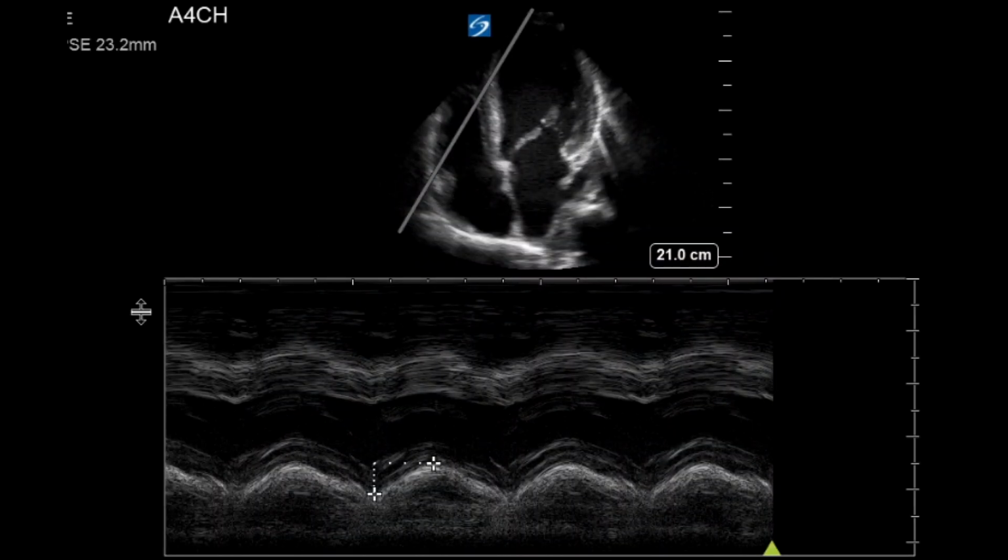So right now they're trying to show something called TAPSE. You remember what TAPSE stands for? Yes, we just talked about it. It's tricuspid annular plane systolic excursion. Good. So that is another technique where we're using M mode, but instead of looking at the tricuspid valve, we're looking at what's called the tricuspid annulus, which is a soft tissue around the valve, and it's on this lateral free wall. So they have the cursor over the lateral free wall of the RV, and you're measuring the up and down movement of the RV in that area with M mode.